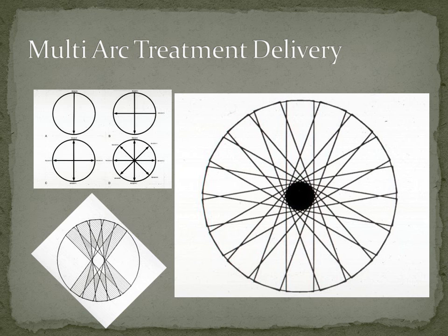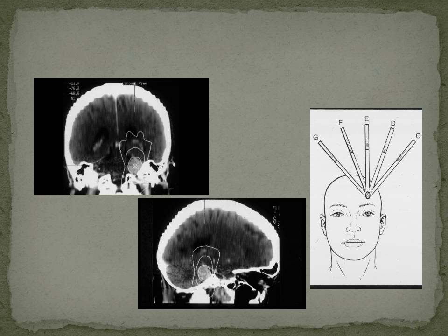And so I can spare tissues by removing some of these arcing planes. The penalty for that is that I have fewer arcing planes to average out, and I spread the dose in other planes. And that's at times beneficial. If I'm doing a pituitary treatment, I may decide to actually eliminate some of the planes so that I stay off of the chiasm better. And so there are these abilities in the planning systems to go ahead and remove some of the beams. We'll do that, and you'll see how that works. Okay? Here's an example of just removing the beams to stay off of lateral structures.